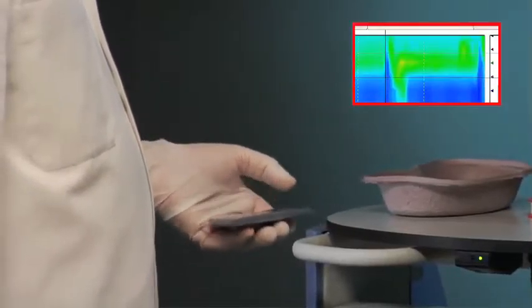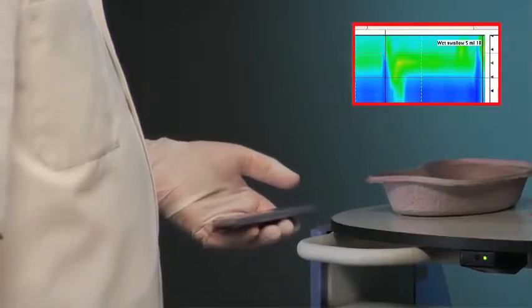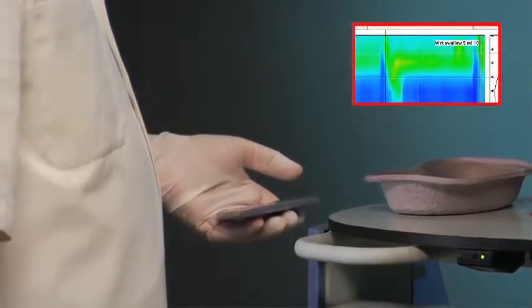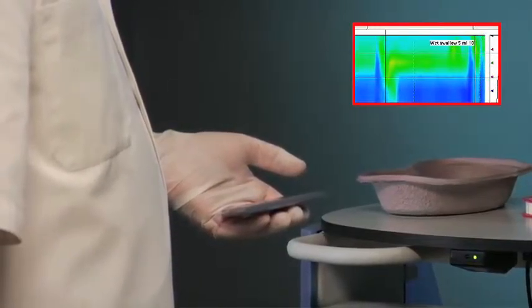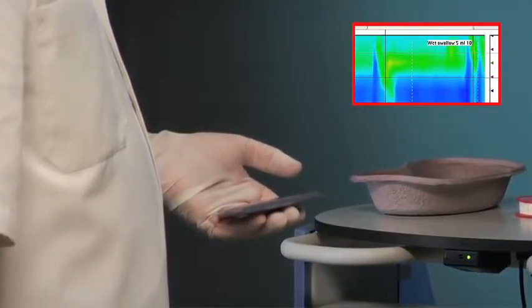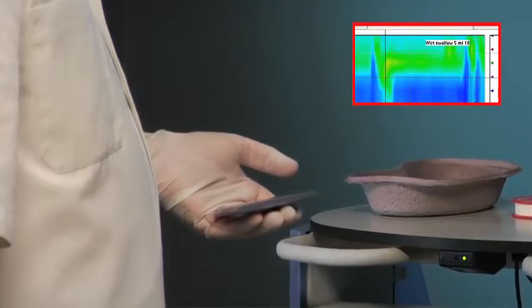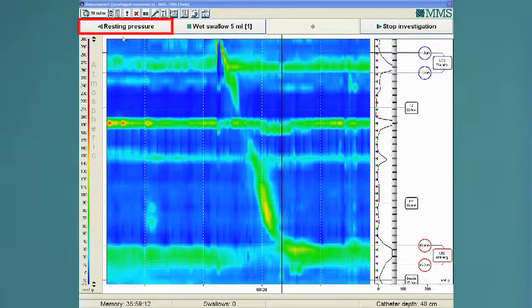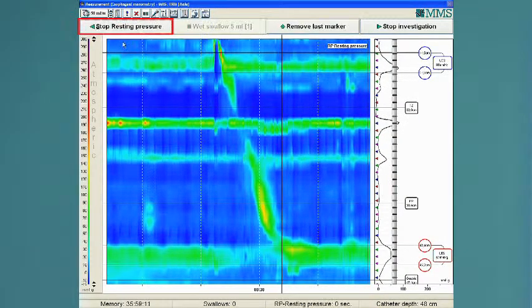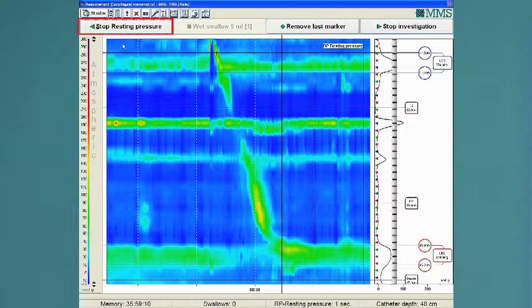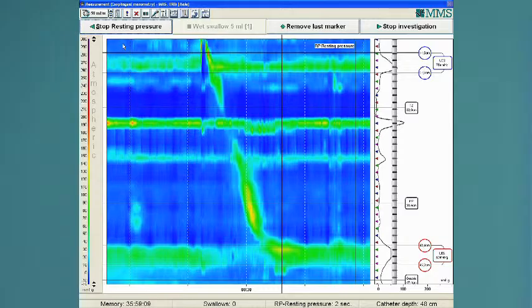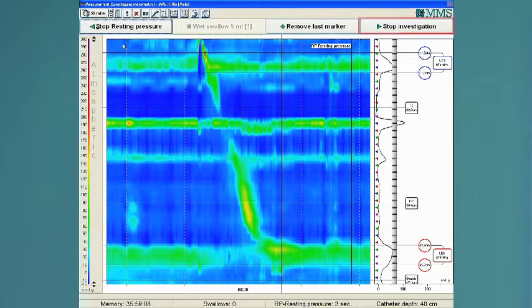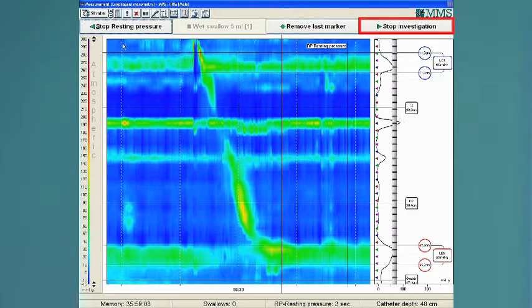Please note that you can easily mark the swallows with the remote control. Finally, measure the resting pressure for 20 seconds. Finish the examination.